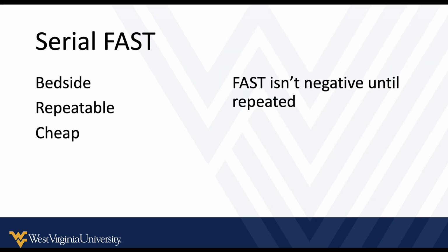And just hopefully that hits on the serial FAST exam. It's bedside, it's repeatable, it's cheap, especially if you have a patient who's unstable and you haven't found the clear source of their shock. You start some resuscitation. 10 to 15 minutes later, if you're still in the trauma bay, you can repeat that FAST exam to see if anything has changed. And sometimes things do change as resuscitation goes on. One of my surgical colleagues says that the FAST isn't negative until it's been negative twice. And again, one of the beauties of point-of-care ultrasound is it's repeatable at the bedside. You can do it as much as you need to as the clinical scenario evolves.